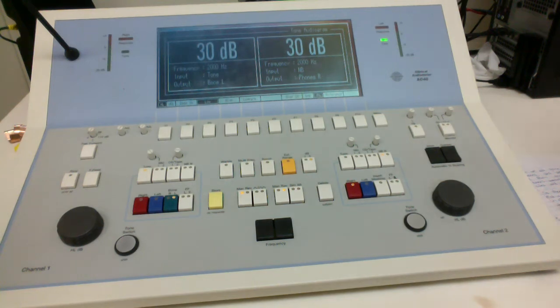So let's switch and talk about bone conduction masking, which is going to be the last of the videos for this series to get you prepared for Lab 4. We're still going to keep in mind the patient that we talked about in the air conduction masking video, patient X. If you haven't watched that yet, I would recommend stopping this video and coming back after you've watched it.